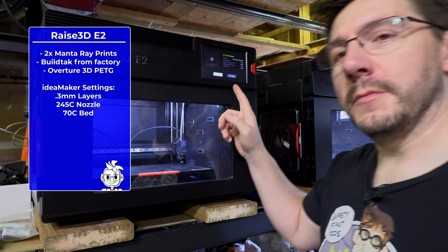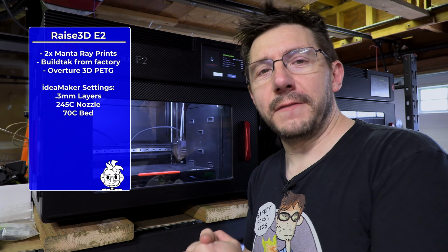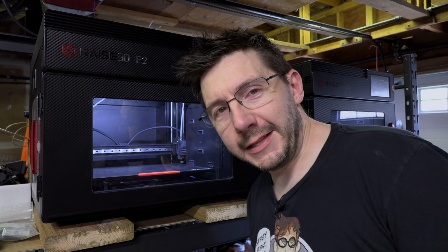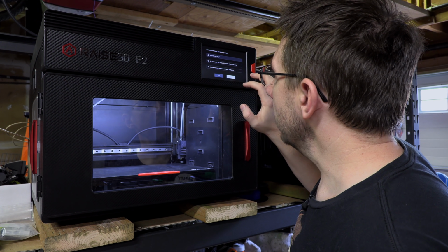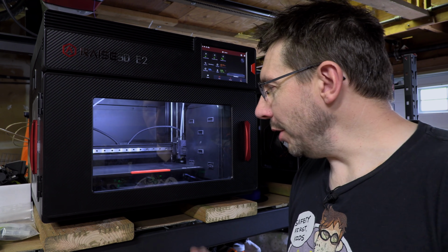On this E2, I've got Overture PETG loaded, and the flexible build plate in place. Up here, because I have a job set up, I just need to tell it if it's a success or a failure. And at this point, it sure was that last one. Then I pick reprint your last job and hit okay. And the printer goes. I like these, they're workhorses.